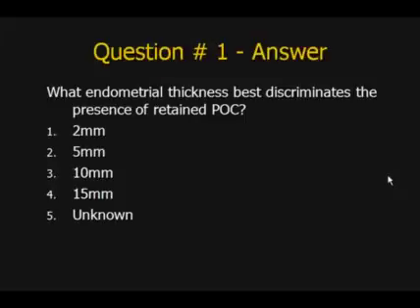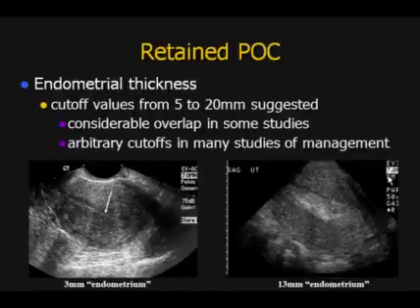Well, we actually don't know what number to use to discriminate patients with and without retained products based solely on endometrial thickness. So now we're talking about the patient who does not have an endometrial mass, but you're just basing the assessment on endometrial thickness.